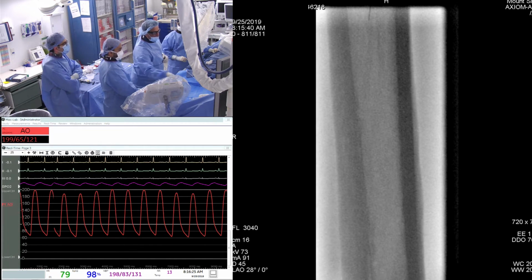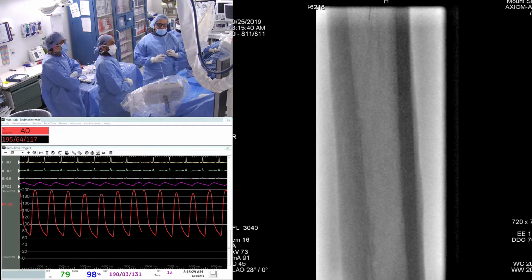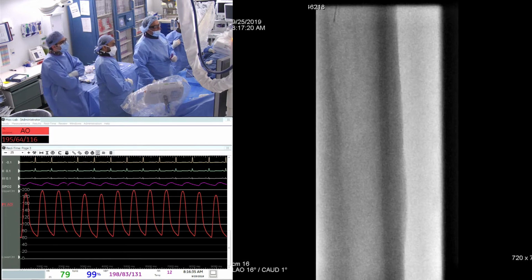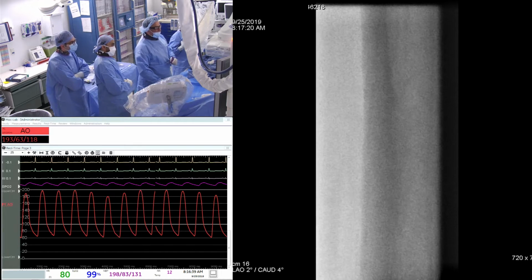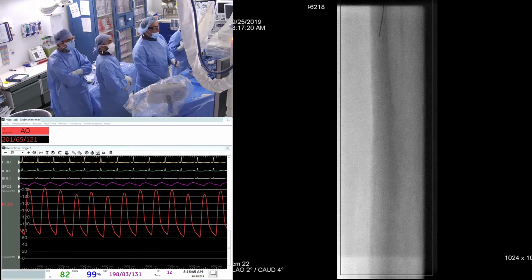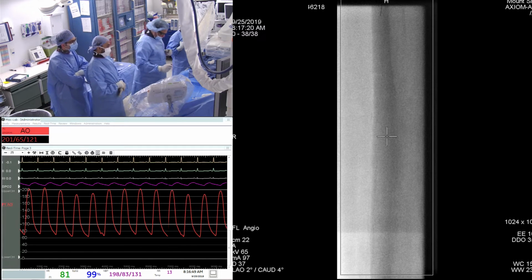As an interventional cardiologist, if it's a coronary or whatever, these guys are very good at figuring out the pathway of the artery. But I think it's important, by knowing your wire and moving your camera, to really figure out, am I in the right area for where the posterior tibial should be? So what I want to do just for teaching purposes is to take a picture here, see whether this wire is heading in the right direction before we advance our catheter and before we balloon.